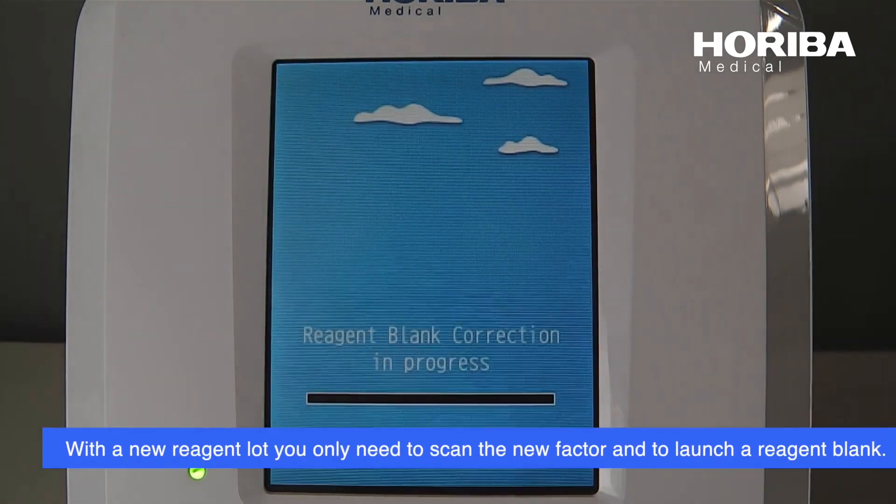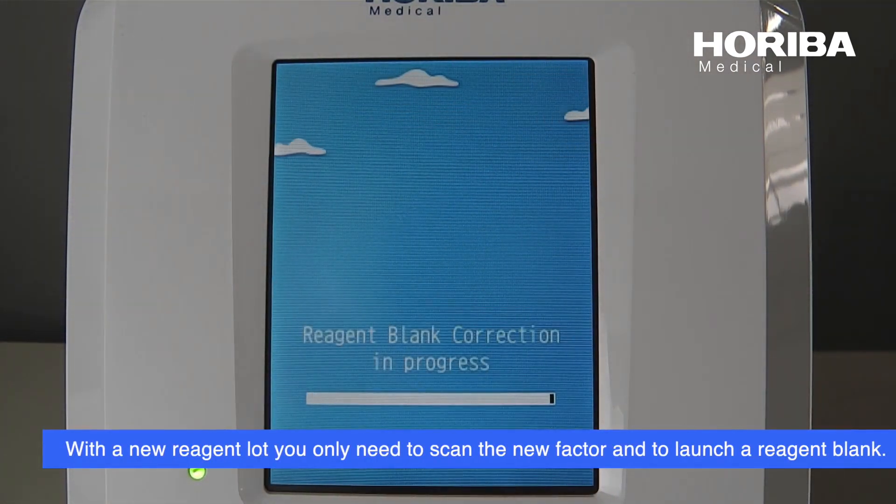With the new reagent lot, you only need to scan the new factor and to launch a reagent blank.